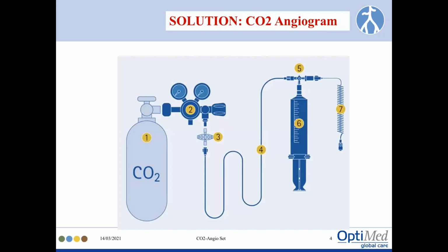What is extra is we need something. We can't obviously connect a carbon dioxide cylinder directly into the blood vessel, because you need some kind of safety. The abdomen is a big cavity. Blood vessel is a delicate thing. So you can't just pump carbon dioxide gas blindly. So you have this kind of a gauged valve with all the safety features.